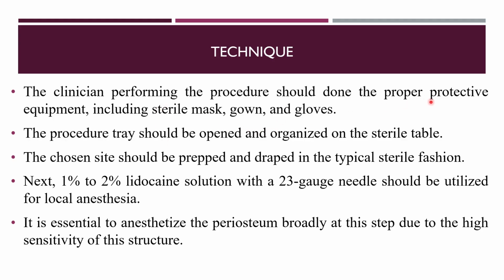This procedure involves specific guidelines, such as the clinician performing this technique should wear protective equipment like the PPE kit, or not even the PPE kit, but if he can just include the sterile mask, gown, and gloves, then it is fine. The tray should be there in which all the sterile equipment should be kept. Then typical sterile drapes should be there, which I have shown you in the picture, so that whenever we are collecting the bone marrow sample, the other parts of the body do not get infected by that aspiration, right?